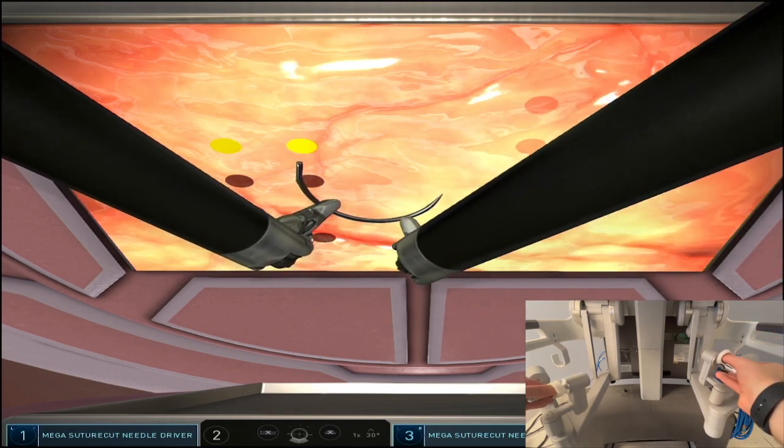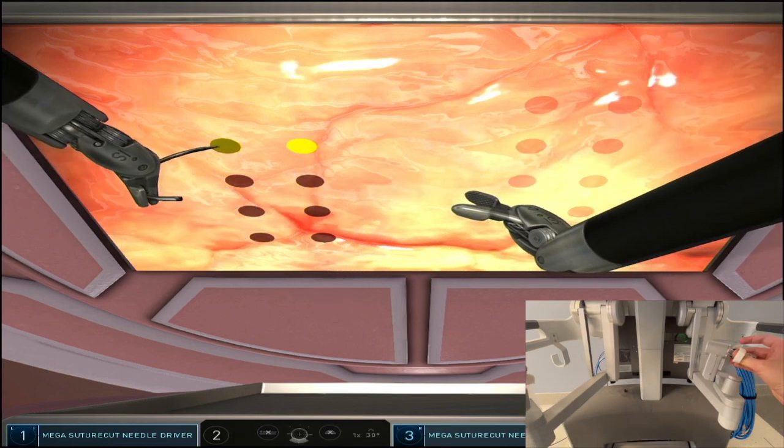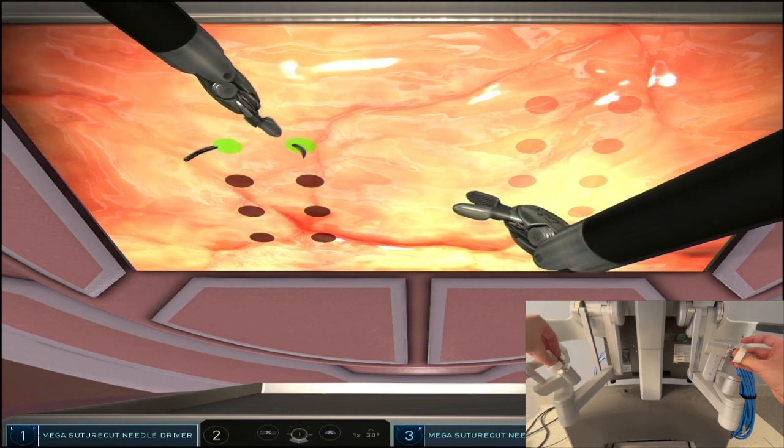You're more efficient in the actual operating room. Here I'm switching hands and taking the remaining bites with my opposite hand. Thank you.